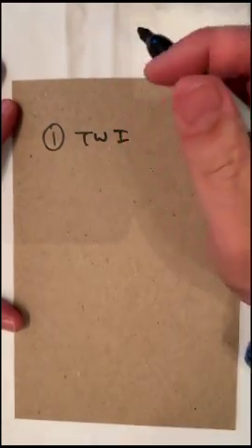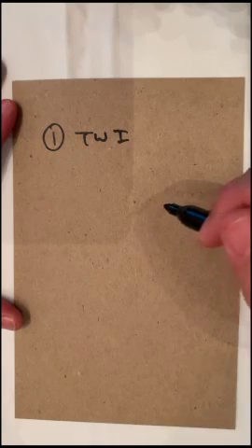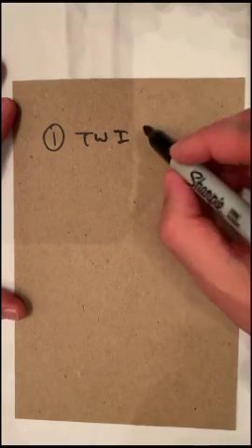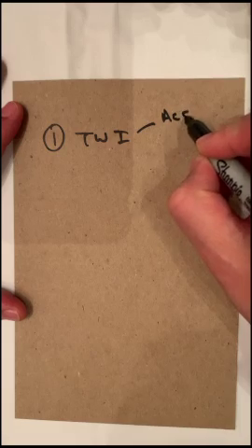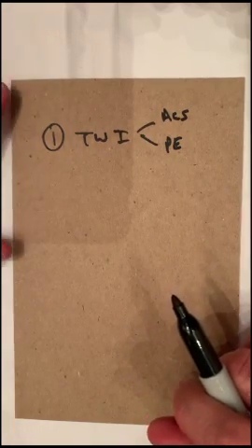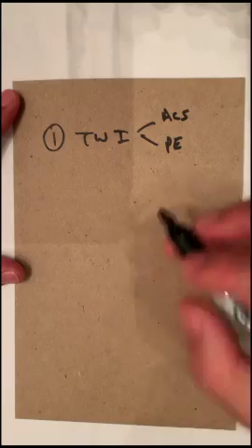Now, I don't know about you all, but when I was in residency and med school, I learned that T-wave inversions equal cardiac ischemia. Not so. T-wave inversions can be cardiac ischemia, but it can also be PE. And as I mentioned, there are some studies indicating that T-wave inversions are the most common abnormality with PEs.